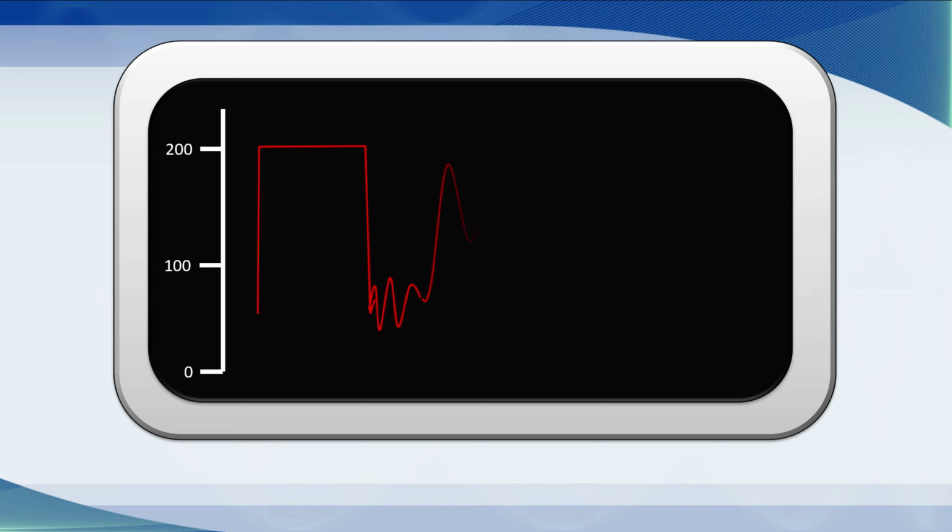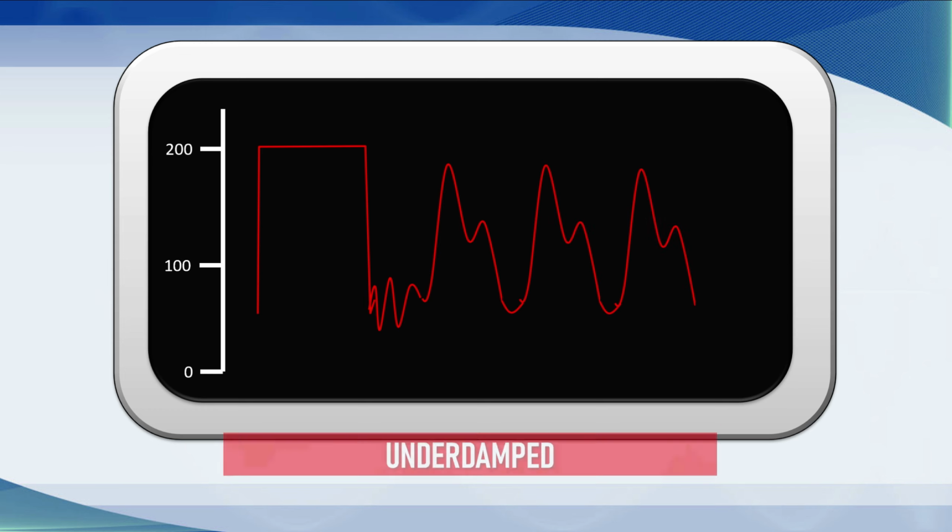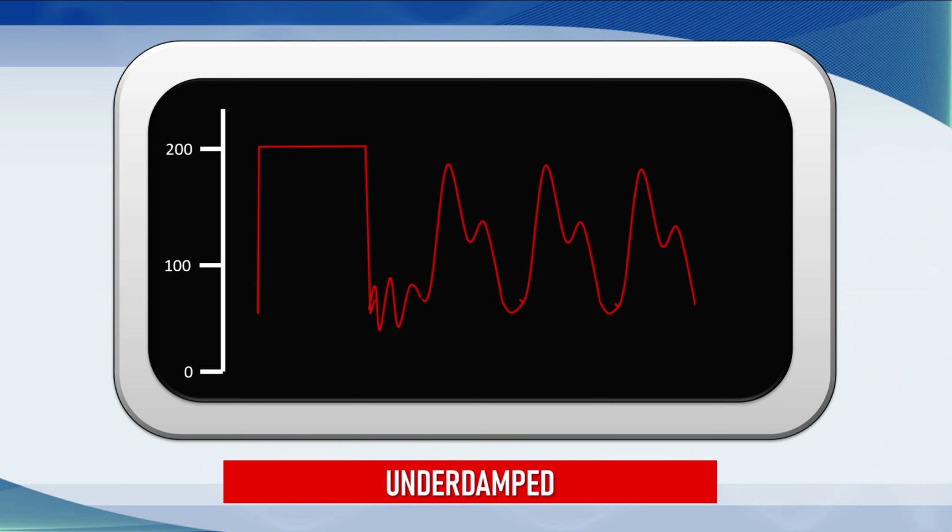This is an underdamped arterial line trace. You can see significant overshoot after the flush followed by more than 2 superimposed oscillations. This means that there is too much resonance in the system, and it results in an overestimation of the systolic blood pressure and an underestimation of the diastolic blood pressure. The mean arterial pressure is accurate. It's often really difficult to figure out why the system is underdamped. It may be a problem with the saline tubing, but we do know that the mean pressure is reliable.